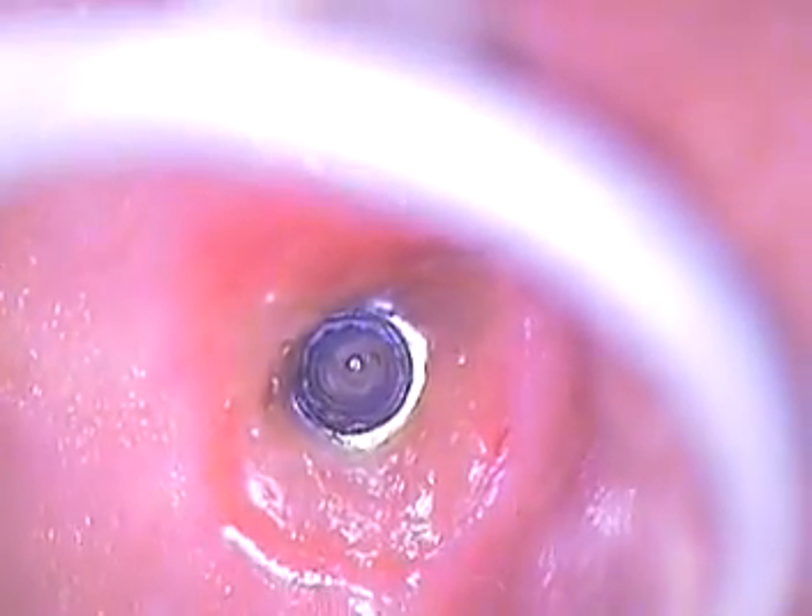We're going back in the mouth now. We're pre-soaking the posterior implant again, and now we're going to pre-soak the vacant implant so we can go in and further clean the threads, because the patient has an appointment right after ours with his general dentist.